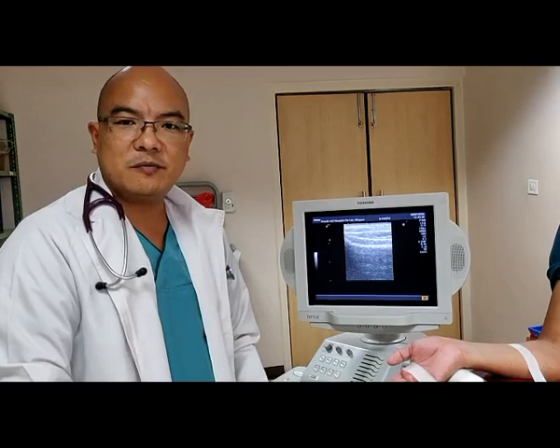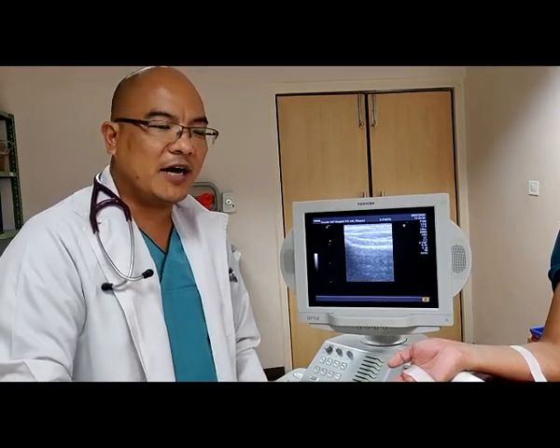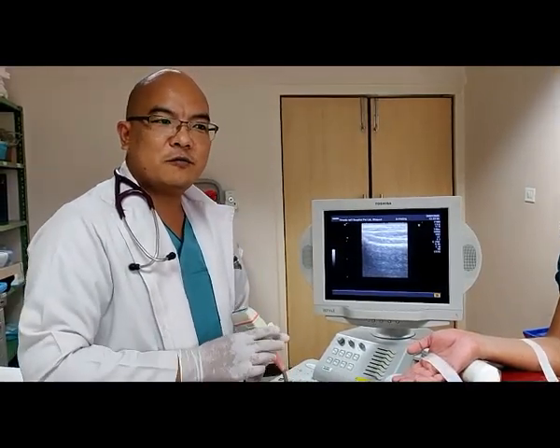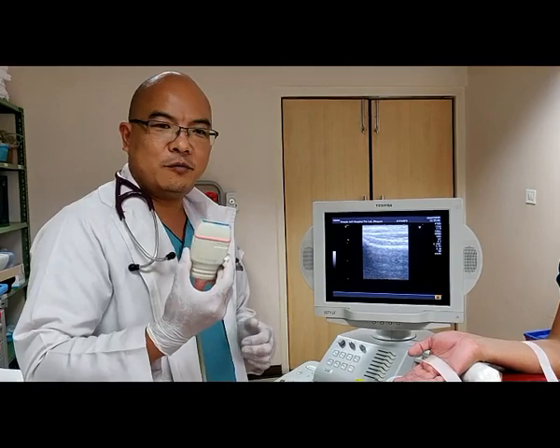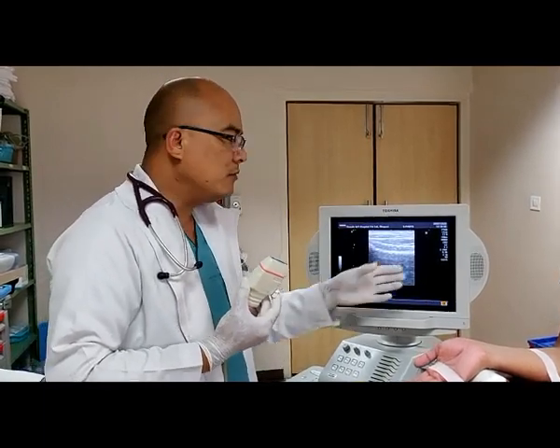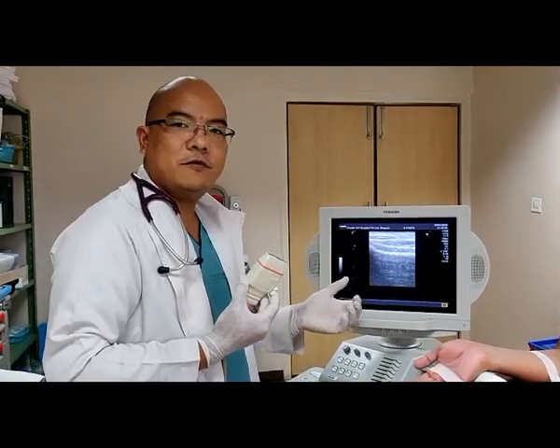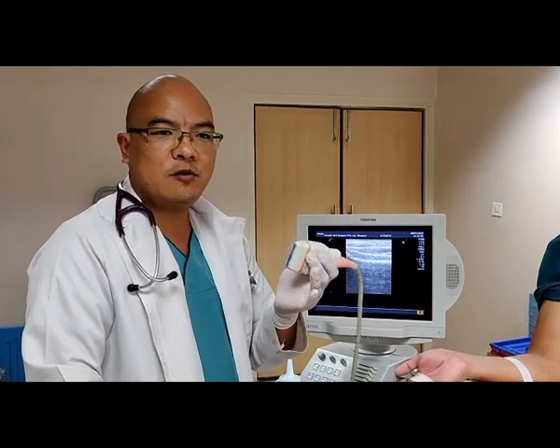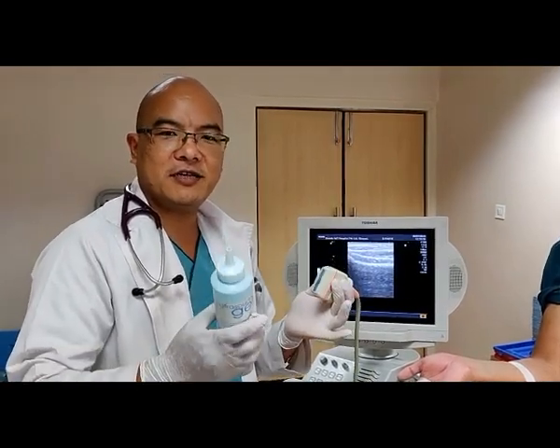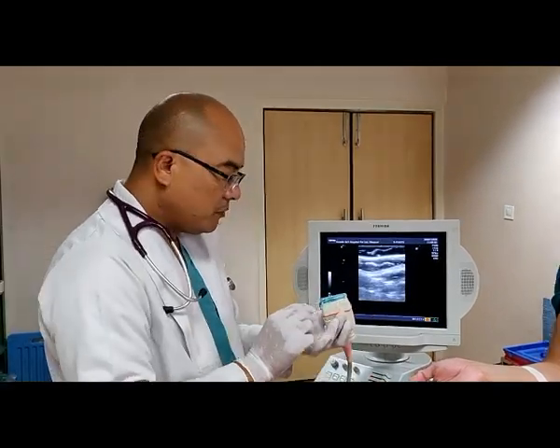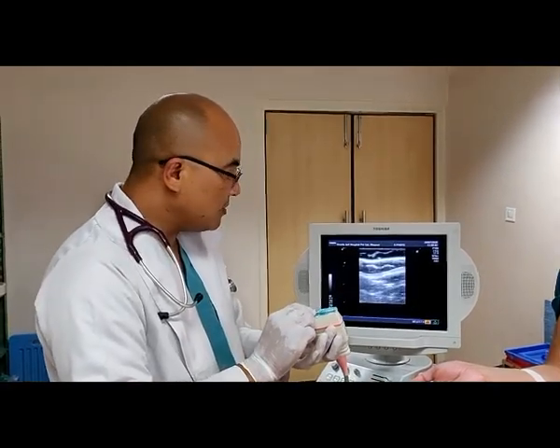Ultrasound is one of the best methods to identify the artery. For the ultrasound, we need a linear probe, and we have to adjust our view. We have to hold our probe with the pen-holding technique, apply gel, and orient our position.